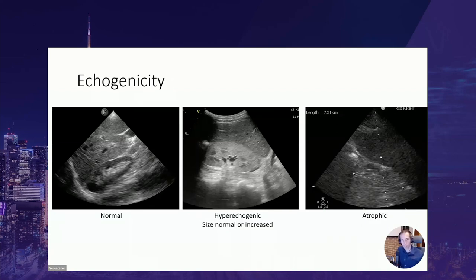You can also note the echogenicity of the kidney. In the normal image, the cortex and parenchyma are generally of lesser echogenicity than the liver. The kidney can become hyper-echogenic in abnormal states. In the center image, this is acute kidney injury due to acute tubular necrosis — after a few days the kidney can become hyper-echogenic. On the right is chronic kidney disease with the patient on dialysis, where the kidney is atrophic and hyper-echogenic, blending with surrounding abdominal fat and becoming very difficult to see.